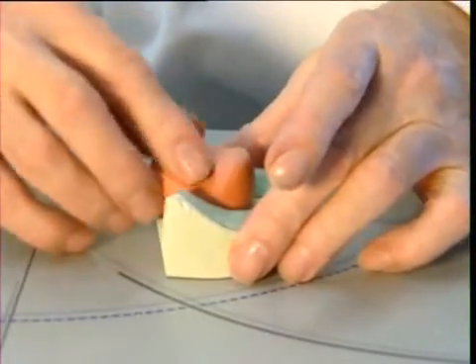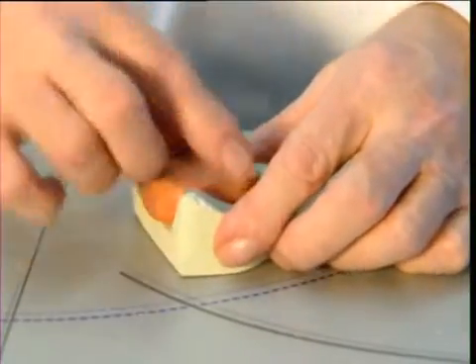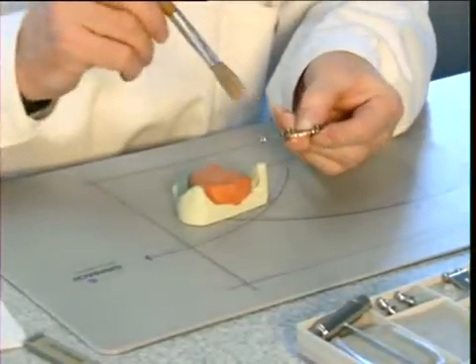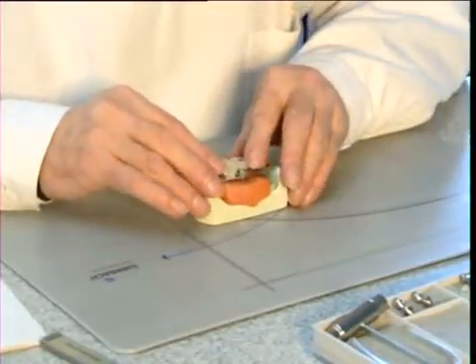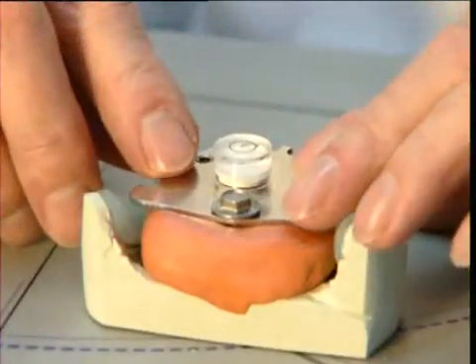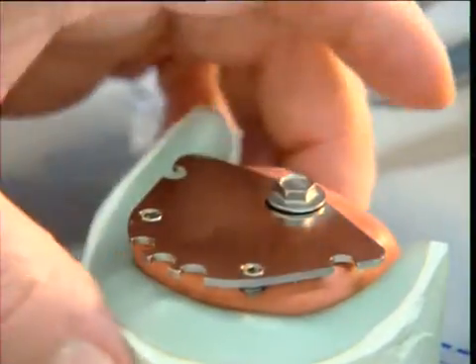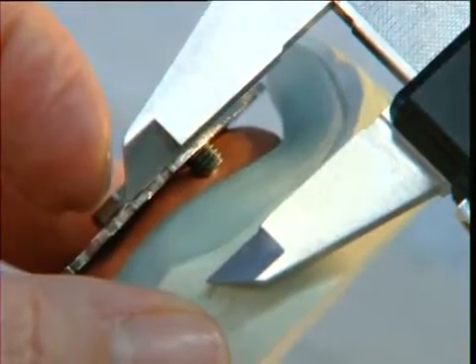Use Combisil to build up a support on the lingual aspect of the model for the lower tracing plate. Coat the grub screws with Vaseline. Place the plate on the Combisil and level it with the spirit level. Set the caliper gauge to 15.5 millimeters and use it to determine the level of the top edge of the plate, measured from the deepest area of the vestibular fold, adjacent to the labial frenum.